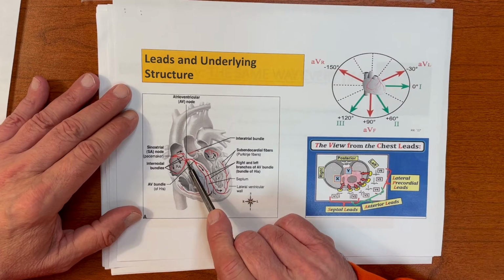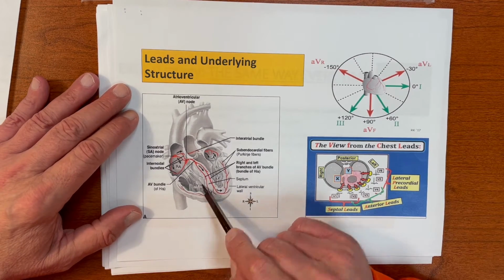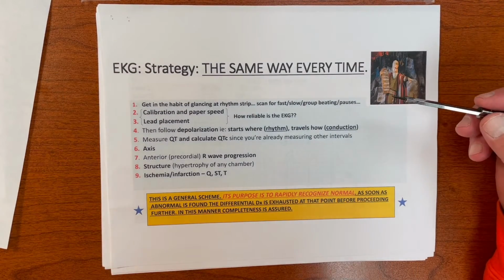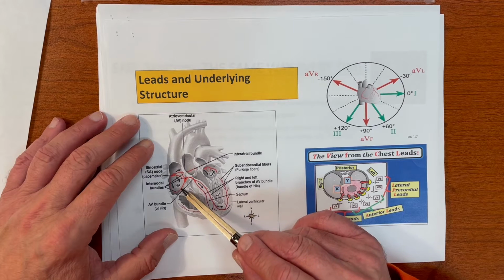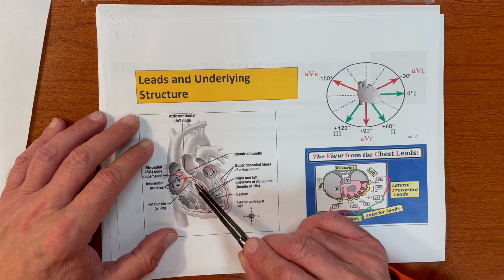Does it start in the AV node? Or does it even start in the ventricle? This is our mission. All right? Once we determine where it starts, we'll determine how it conducts. So if it starts up here, we'll want to make sure then it propagates distally normally through all these structures.